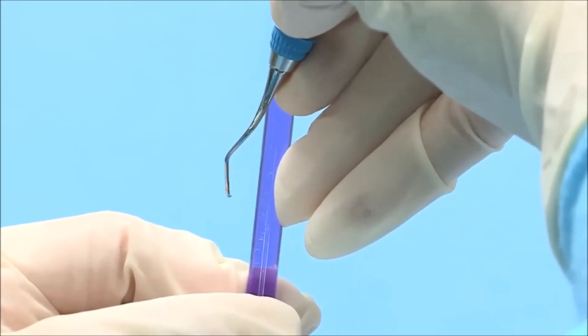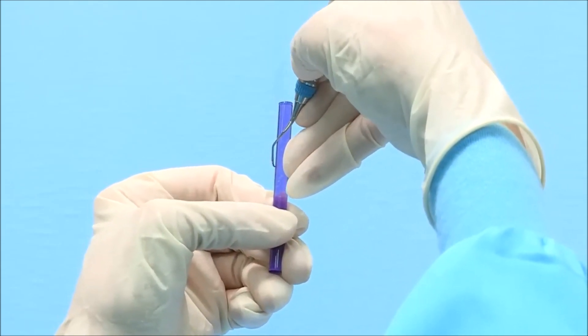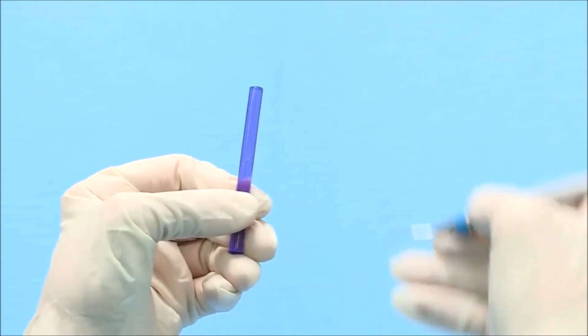If the instrument is sharp, it will bite or grab the test stick. You will also hear a metallic sound or ping when the instrument is removed. Be sure to test the entire length of the blade.